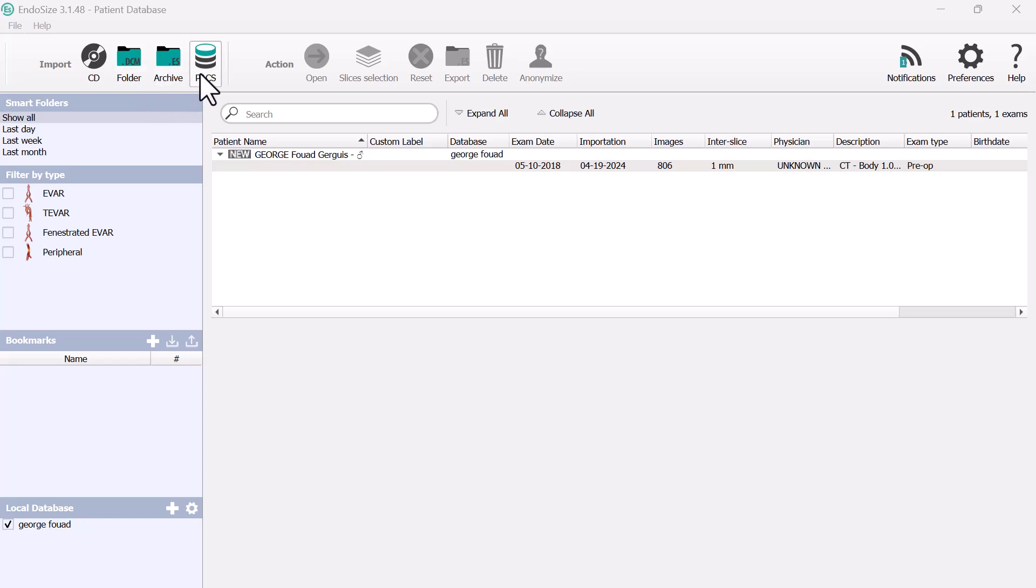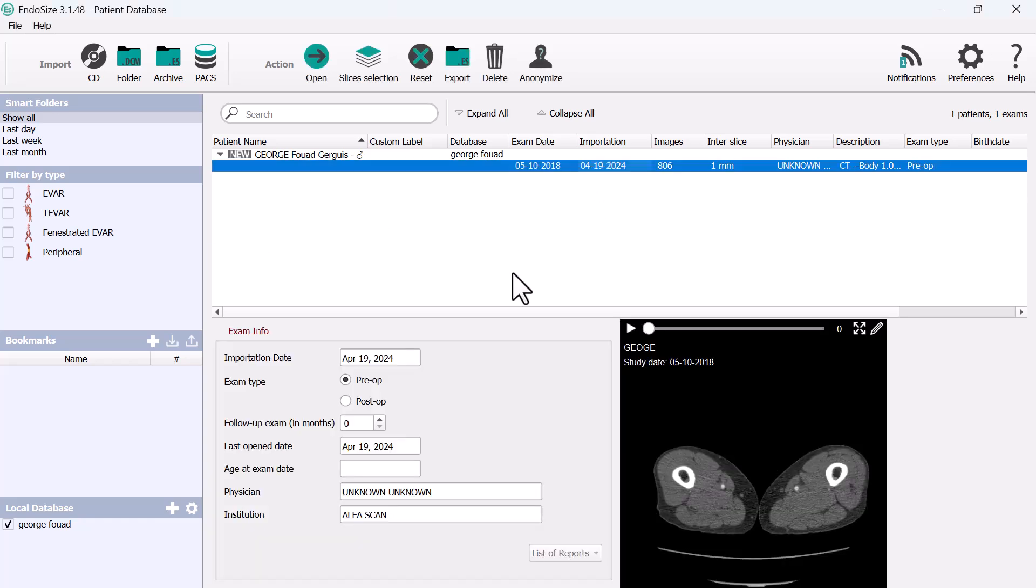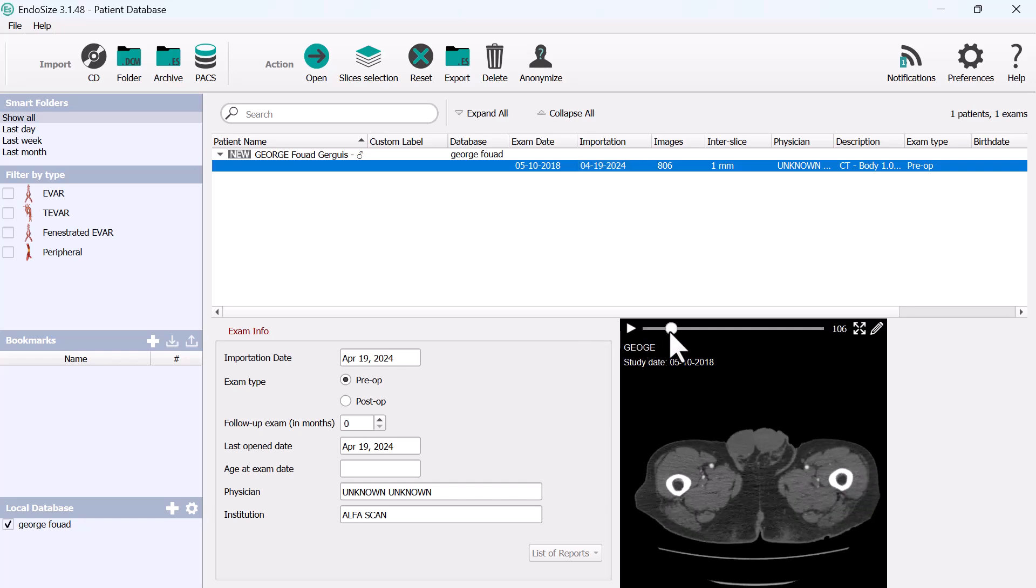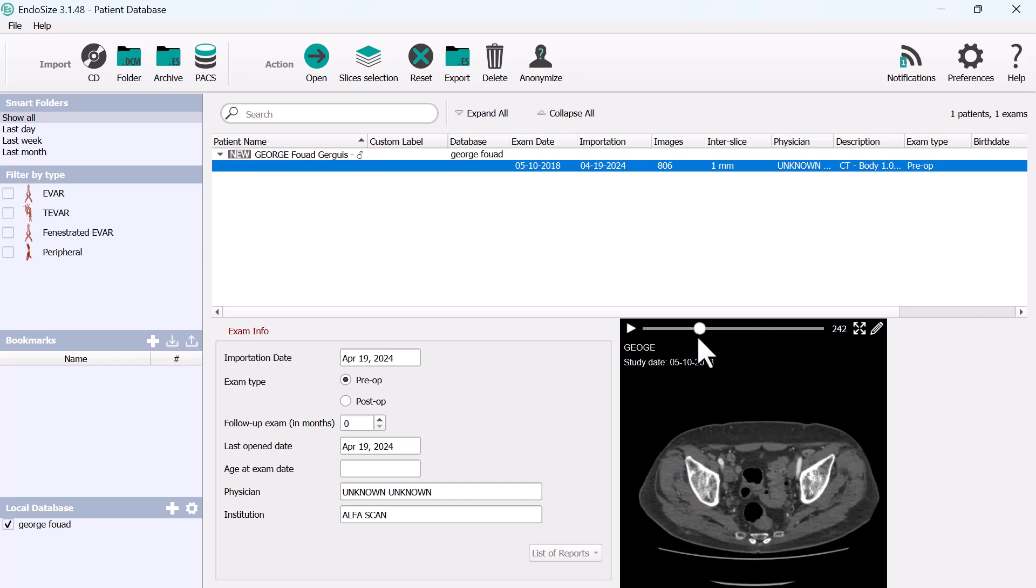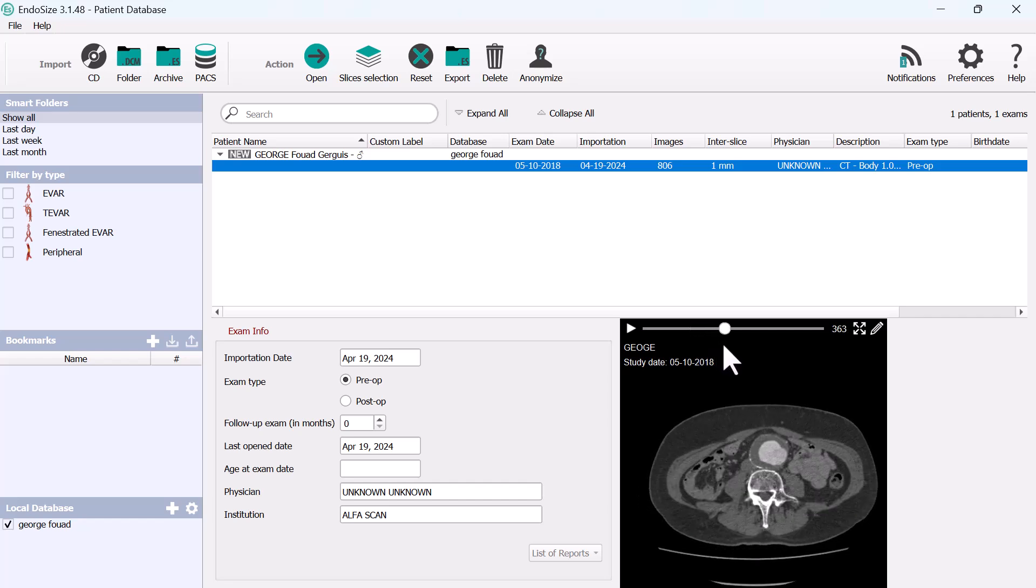From PAC system, you can have either EVAR or TEVAR or fenestrated EVAR or peripheral intervention. Let's say that we selected this patient and you can check that this is the patient with 6 cm aortic aneurysm that you are going to repair.